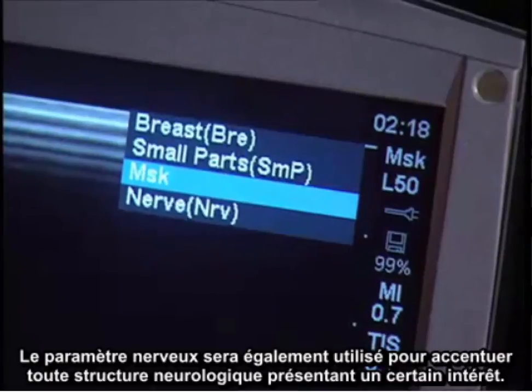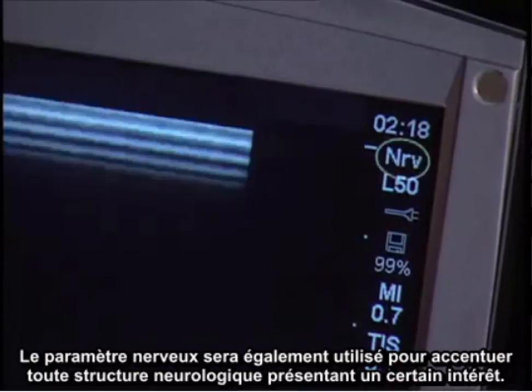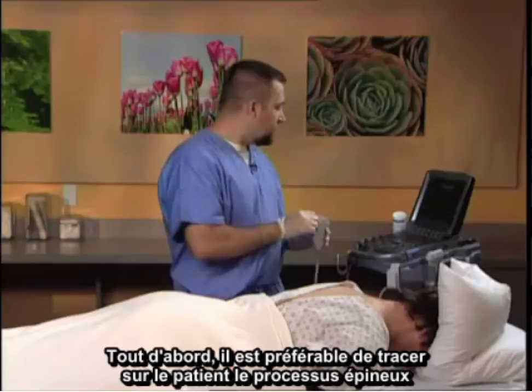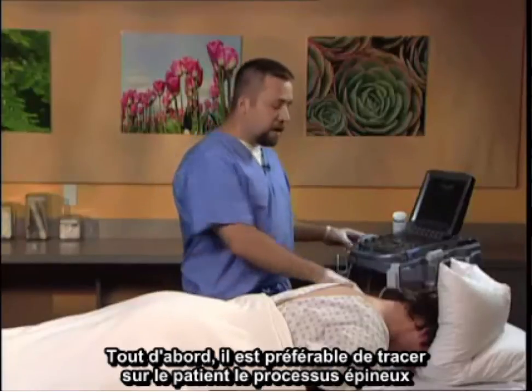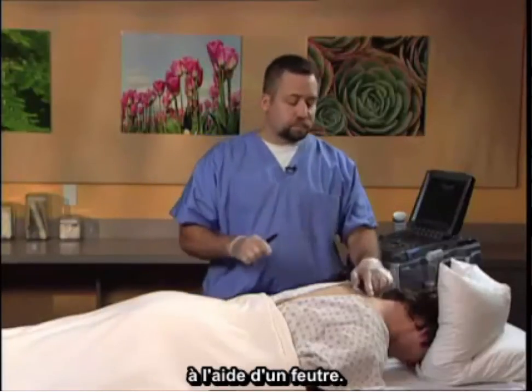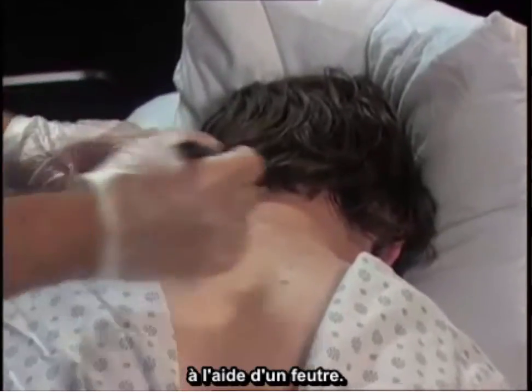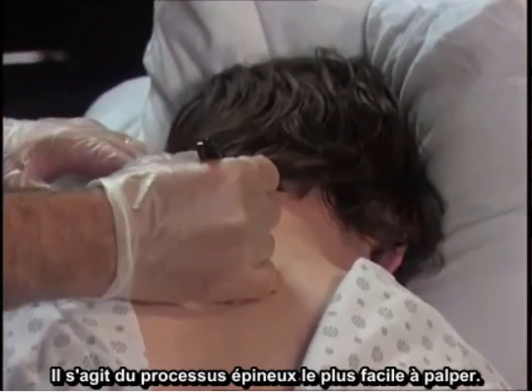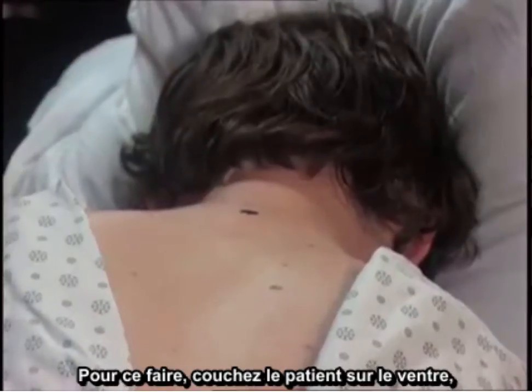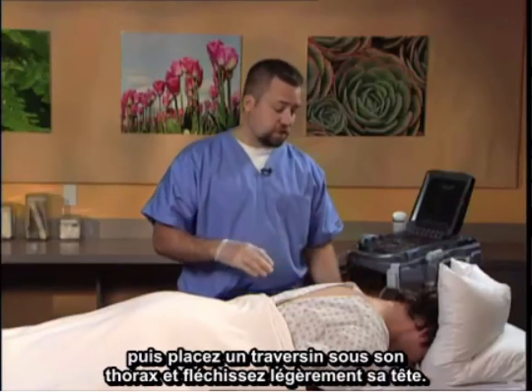The nerve setting will also be used to highlight any neural structures that may be of interest. On the patient, I initially like to mark utilizing a sharpie the C7 spinous process. This is the most easily palpable spinous process, and this is facilitated with the patient in the prone position.